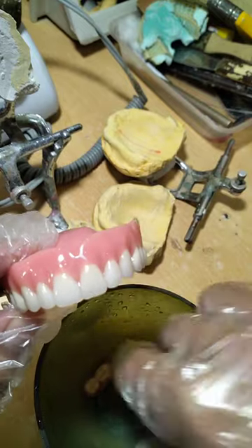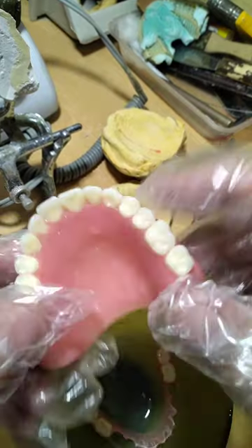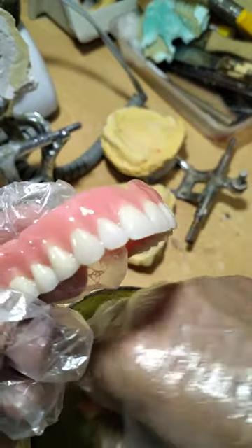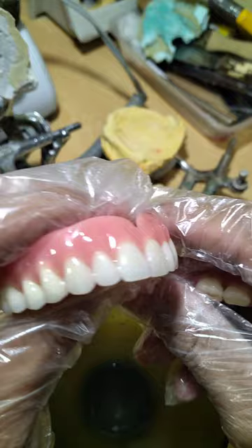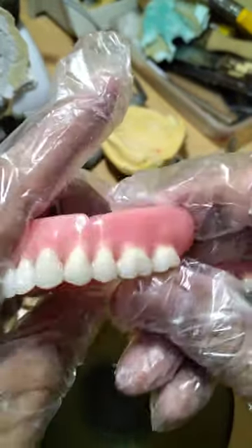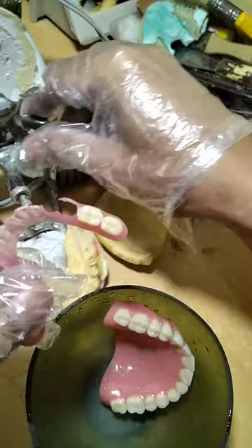Pumunta kay Doc Julius at nagpagawa ng Ivocap denture. Ito yung Ivocap denture niya — maputi yung ipin. Kasi gusto ni ma'am ang white, parang silko niya ang dating ng ngipin. Ito ay new SPX composite teeth, at ang base niya ay Ivocap denture. Ito naman yung lower niya.